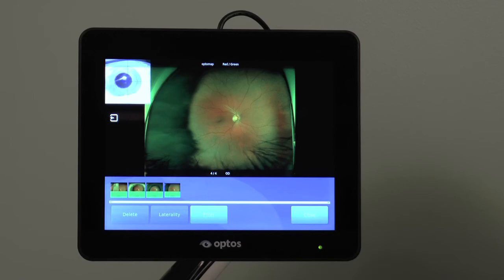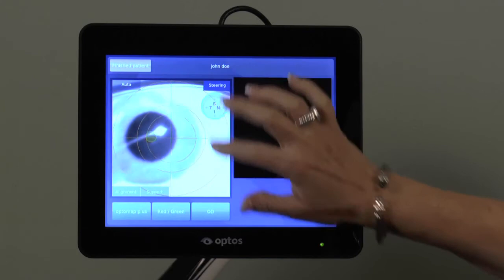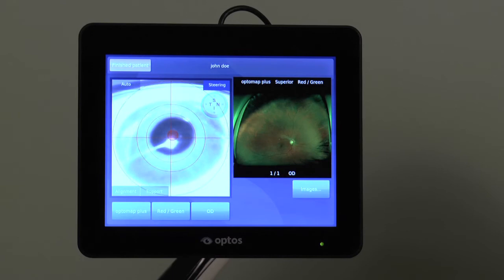Selecting the steering button at the top right will allow you to move the fixation target in order to change the patient's gaze and capture more of the retina in the nasal, inferior, temporal, or superior directions. Align the patient in the same manner you would for an on-axis image and capture when the target is centered over their pupil and has turned green.